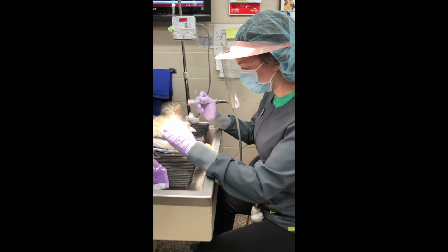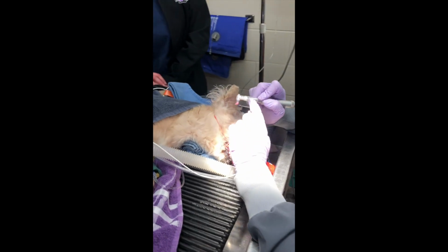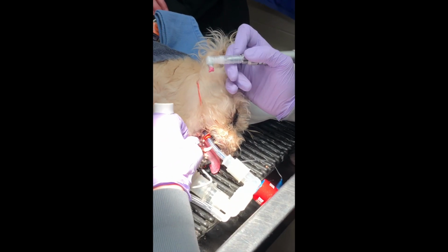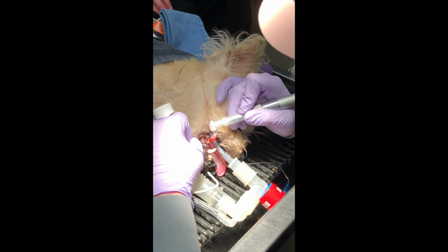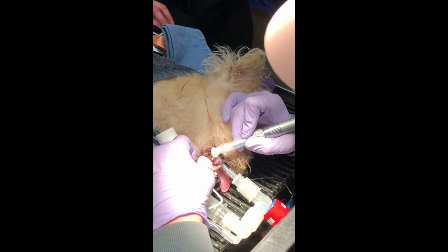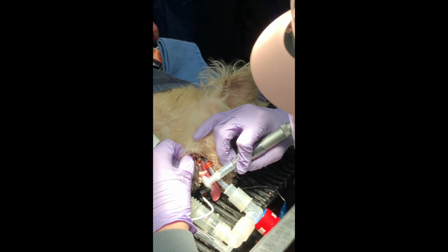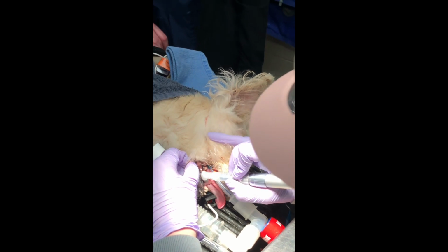Okay, now I'm going to polish. I'm going to make sure I have my slow speed handle with a fresh poly cup on it with some paste. I'll make sure I have plenty of paste. Polishing is going to smooth any pits or scratches caused by scaling. So I'm going to make sure I apply gentle pressure to flare the end of the poly cup to make sure it gets under the gum line. And I'm not going to keep it on the tooth more than 5 seconds, but I want to make sure I get the full surface of the tooth.